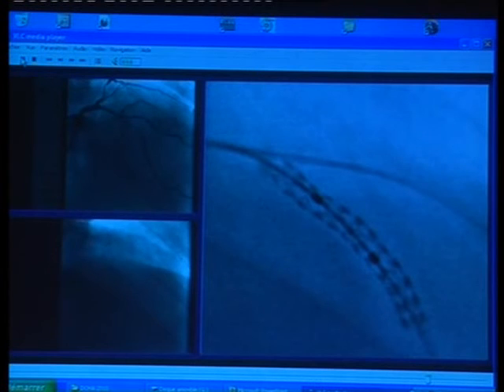Yeah. The result of the stent boost seems correct. I think the stent really looks nice. Yeah, the result of the stent boost is very good. It's very nice, and the struts look really parallel.